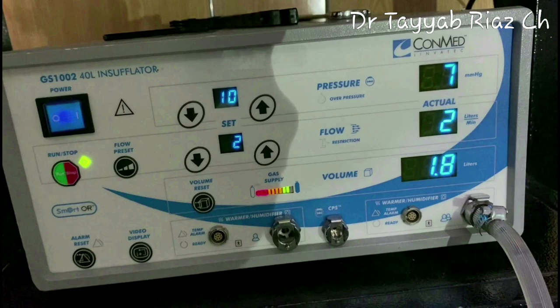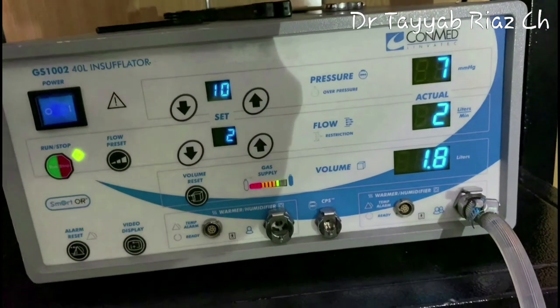And also, if you keep it above 2 liters per minute and the tip of your Veress needle is accidentally lying in a vital structure like the vena cava or gut, then there will be either air embolism or gut dilatation. And while you are on cannula mode after the Veress needle, only then you can increase the flow rate up to 10 to 15 liters per minute, but not more than that. There are some scenarios where you need to increase the flow rate up to 40 liters per minute that I will tell you separately. In this patient, 7 mm of mercury pressure has been achieved and the flow rate is 2.